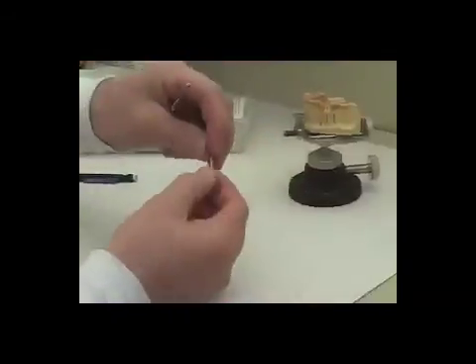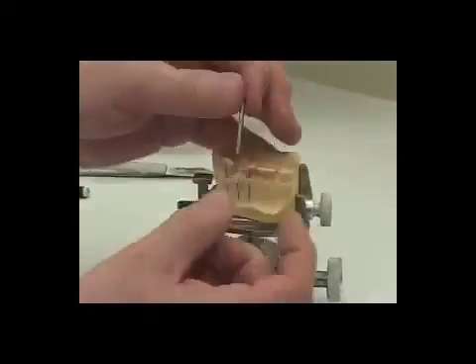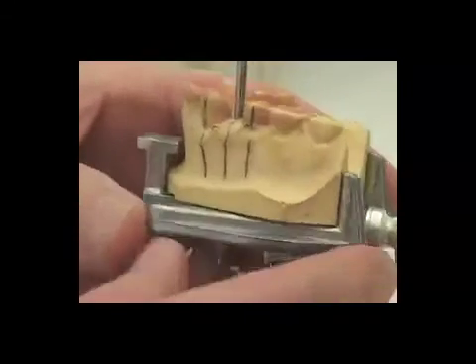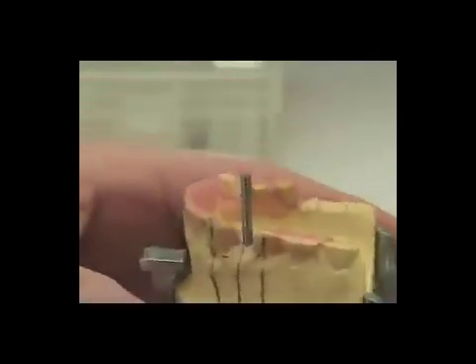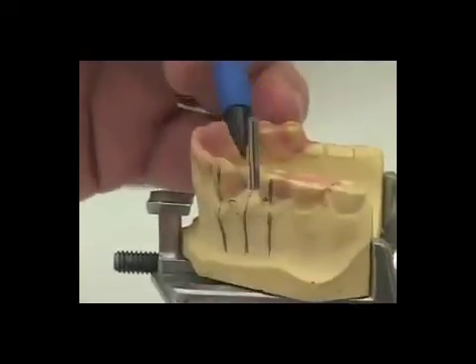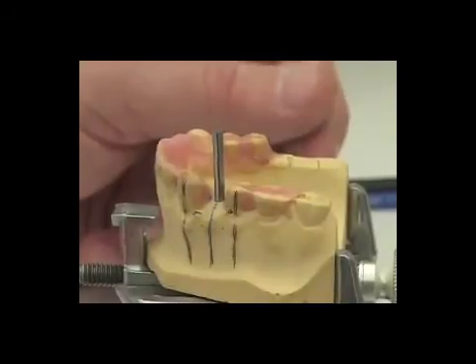We will now be placing the 2.8 millimeter drill blank in the hole we have prepared in the cast. In exactly the manner we did before, we're going to make our next surgical guide that wraps around the lingual 180 degrees of this drill blank. I'll be back in just a few minutes and we'll review the 2.8 millimeter drill guide once it's been adapted around the drill blank.